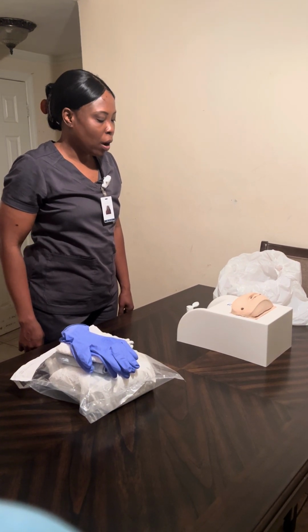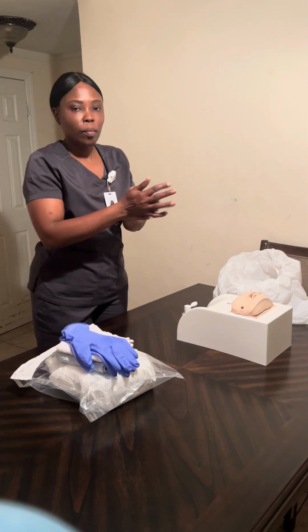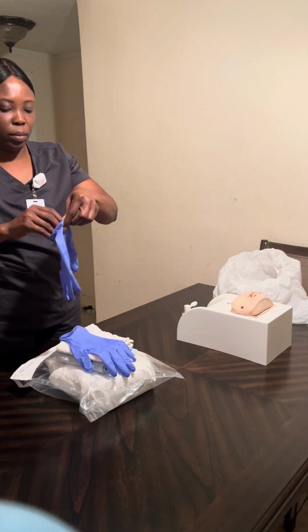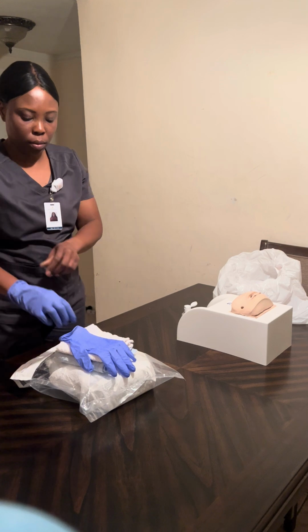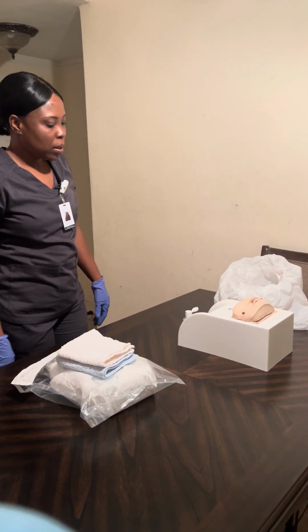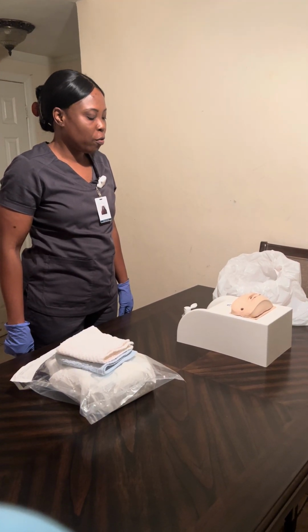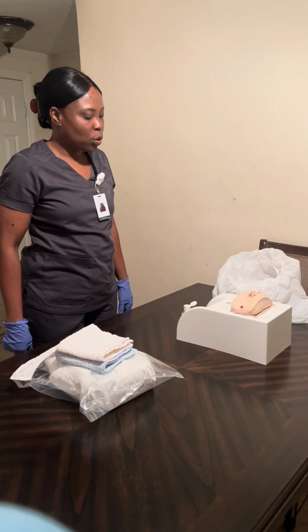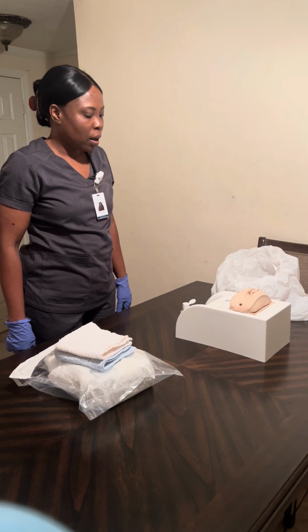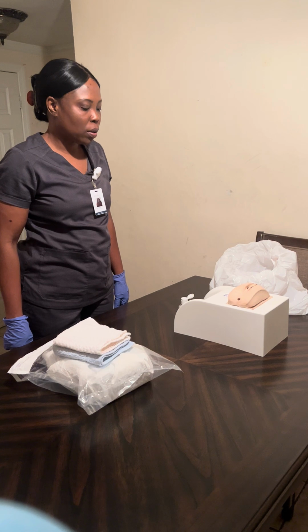Okay, thank you. First, I'm gonna wash my hand. I'll be right back. I use hand sanitizer to wash my hand. I'm gonna apply a clean glove. Hi, Mrs. Smith. Today the doctor has ordered the placement of a Foley catheter. This is a tube. It is going to sit in your bladder to drain urine out. Is that okay with you if I place it for you today? Okay, I have my patient consent.